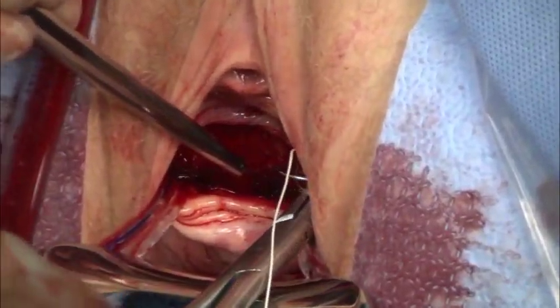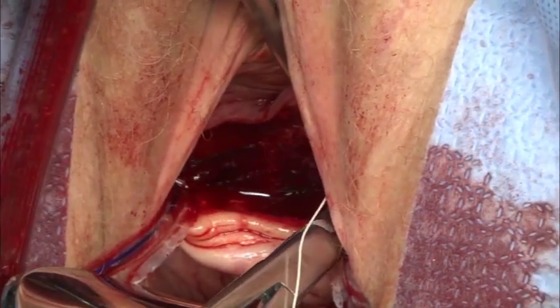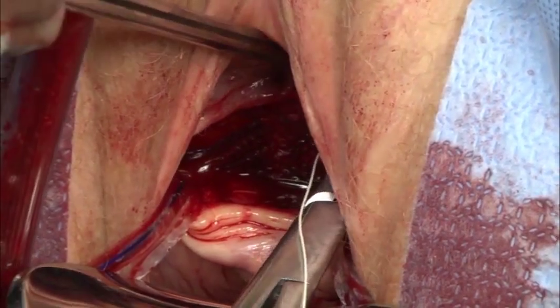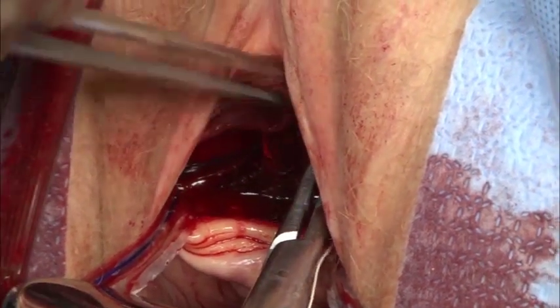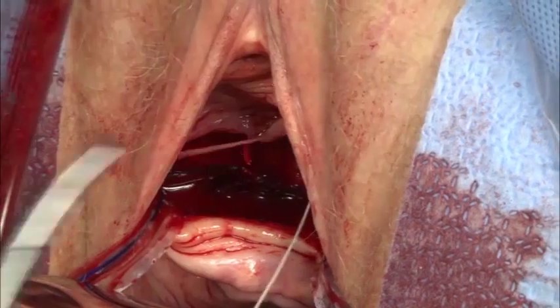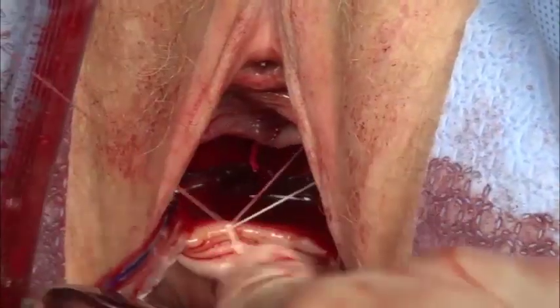The superior edge of the mesh may now be tacked with simple absorbable sutures placed to the right and left side of midline. This enables the mesh coverage to extend up to the highest portion or most superior portion of the cystocele and may prevent shifting of that edge during the healing process.